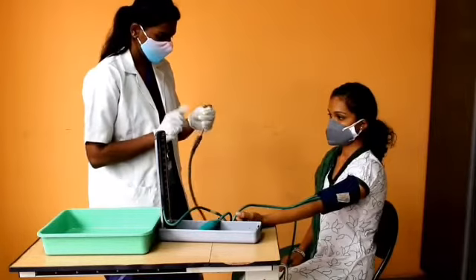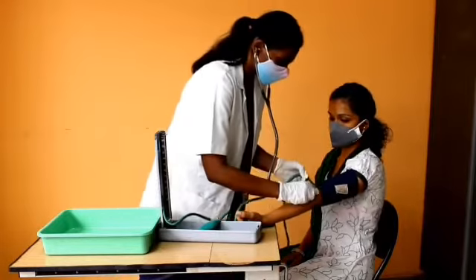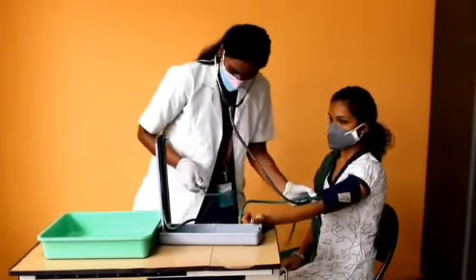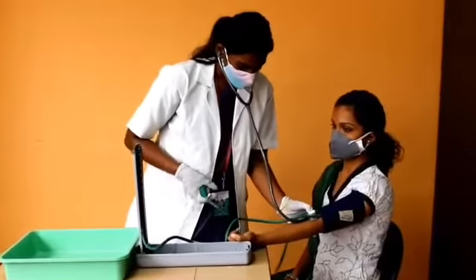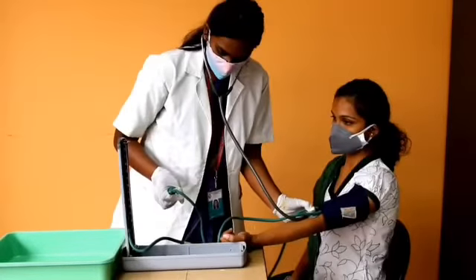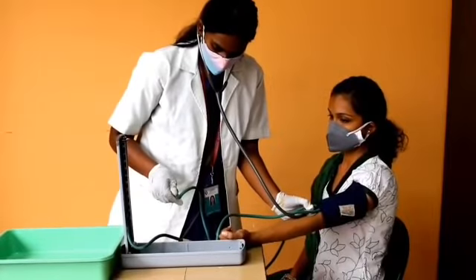Wear the stethoscope and place the diaphragm on the brachial artery. Then close the screw clamp on the bulb and inflate the cuff to 200 mmHg. Open the clamp and allow the aneroid dial to fall at a rate of two to three mmHg per second.